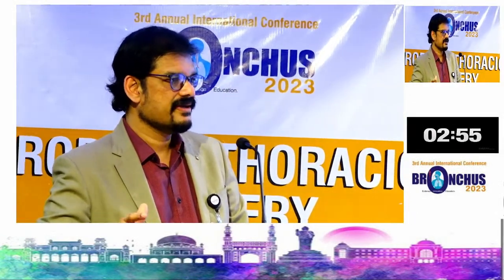No, we don't have that luxury here. I have a team who assist me in every VATS and robotics, so we are used to coordinating amongst ourselves. Ideally you have to have something like a robotic OT team, specialized in docking the robot, passing the instruments, actioning, stapling. So you have to build a team of your own. You can't have a new nurse every day. You can't have a new OT tech every day.